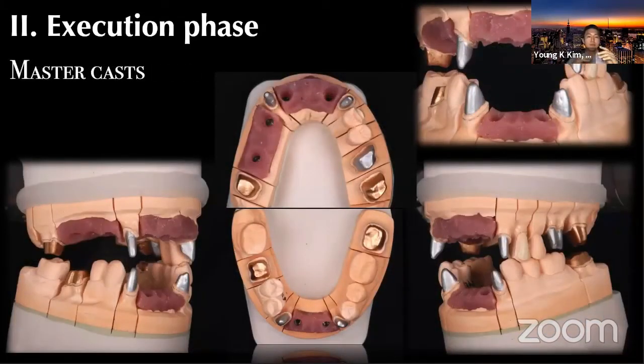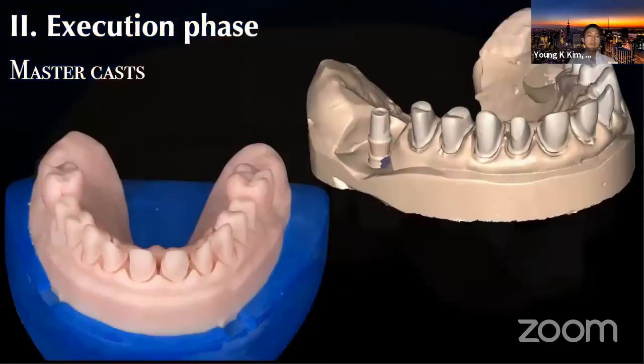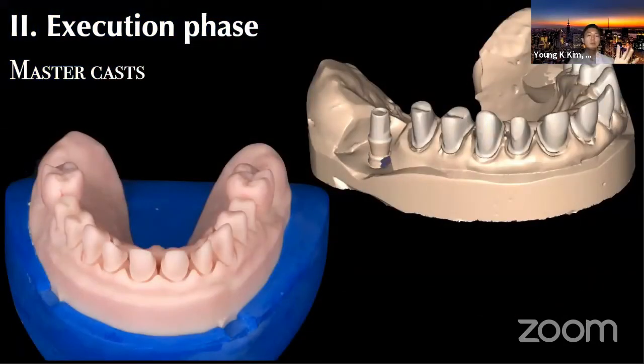And these are the master casts that you will get when you take the proper impression, using all those techniques that I elaborated. In my opinion, they are termed master casts because they need to be handled by masters. We have master technicians, so you also should be master clinicians for this. You will attain these master casts if you take an impression in a proper way, with your customized, sequential process and your assistant as teamwork, and you will be able to attain this quality, the master cast, and then you can move on to the next step.